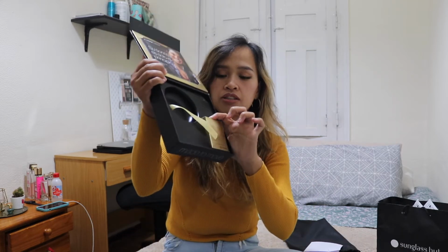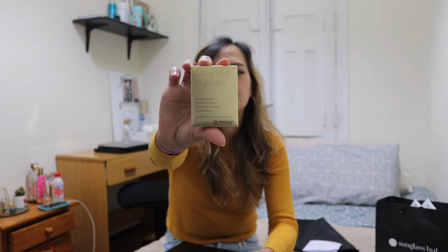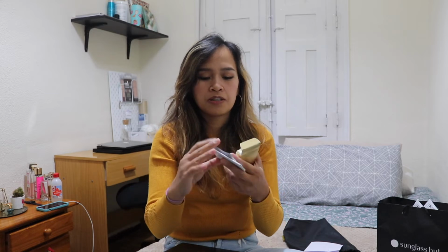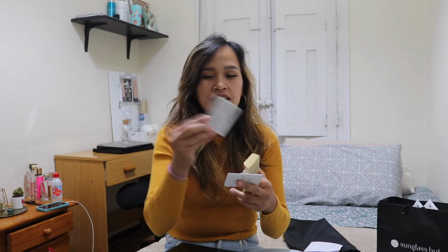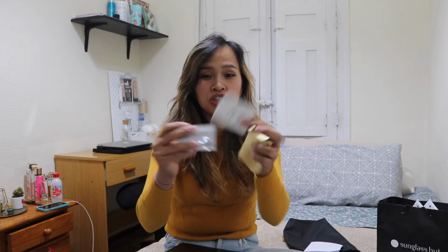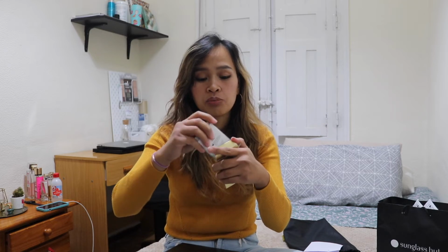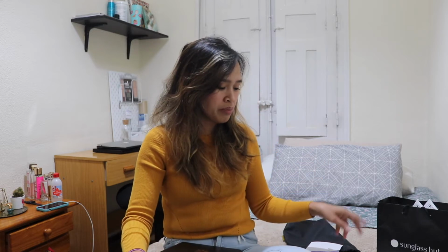Okay, here, these are cleaning crystals. I don't know exactly what this is, it's like a salt or something. There's an instruction here on how you clean your liners. Normally you put them in the water after you wash them, then leave them for a few hours to disinfect. But it doesn't matter much, because you change every week, so they're not going to turn bad.